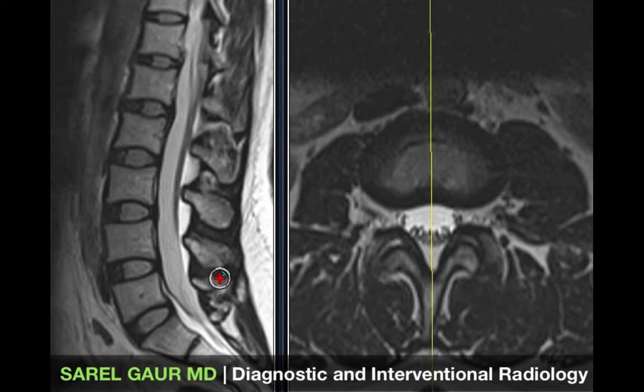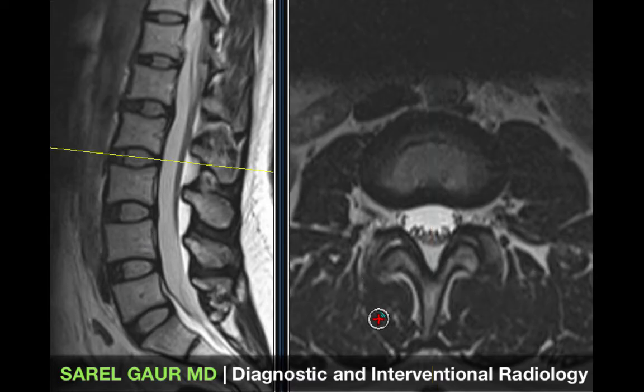Let's go ahead and talk about the lumbar spine MRI anatomy and what you need to know in order to interpret this set of images. I basically have a sagittal set of images here on the left and an axial set of images on the right, and these are both T2 weighted without fat suppression.